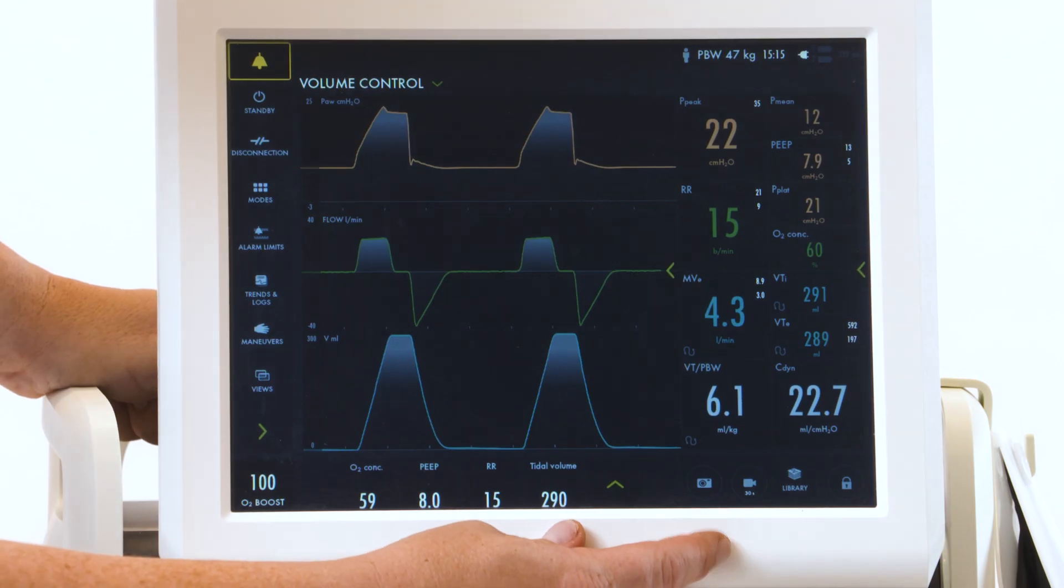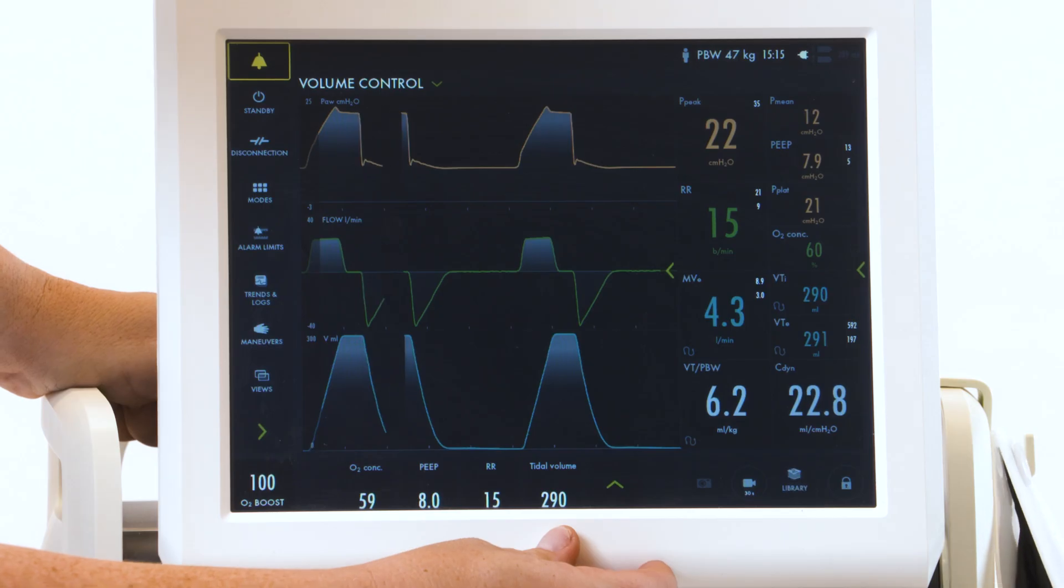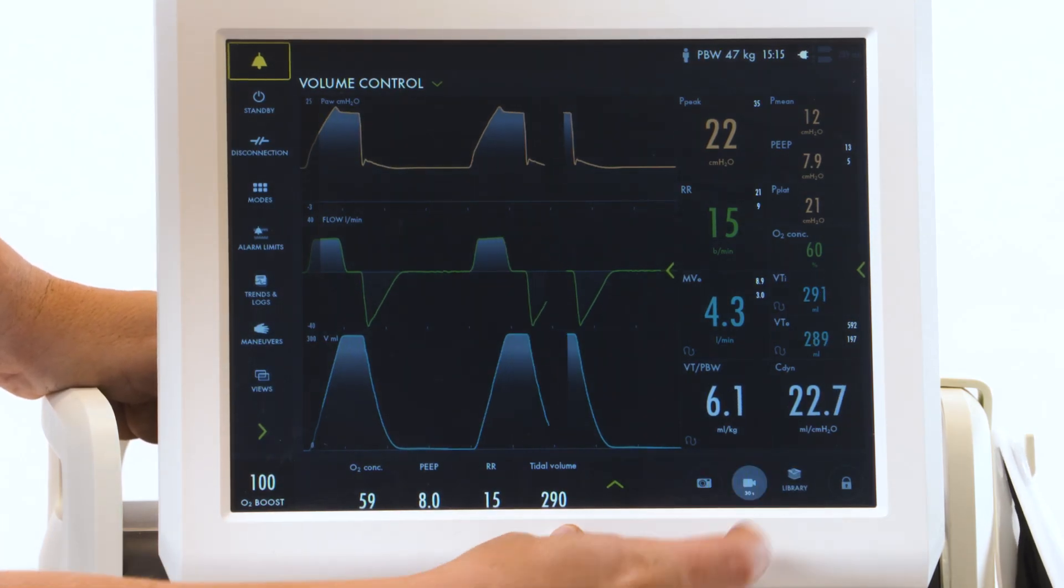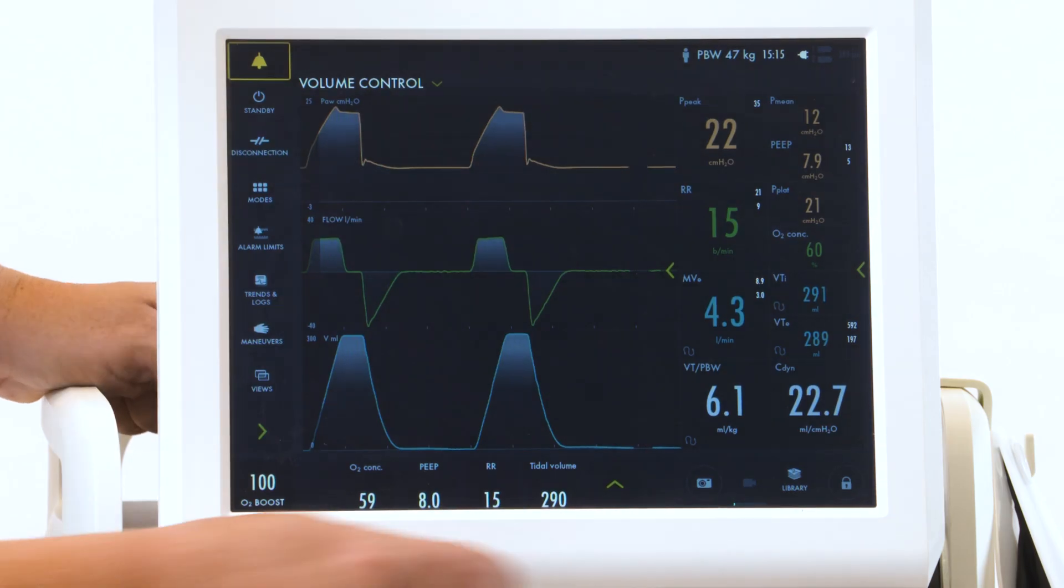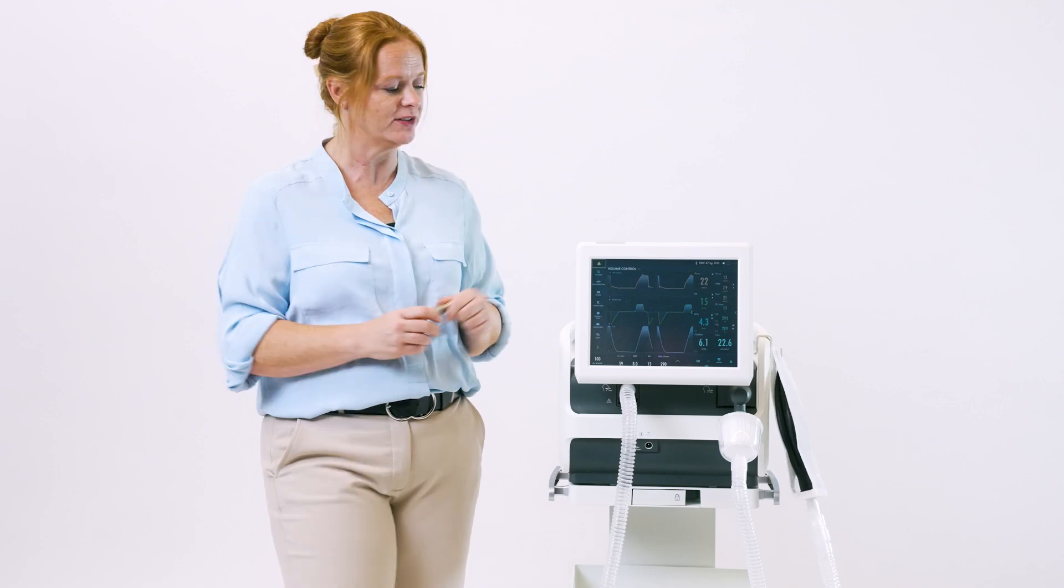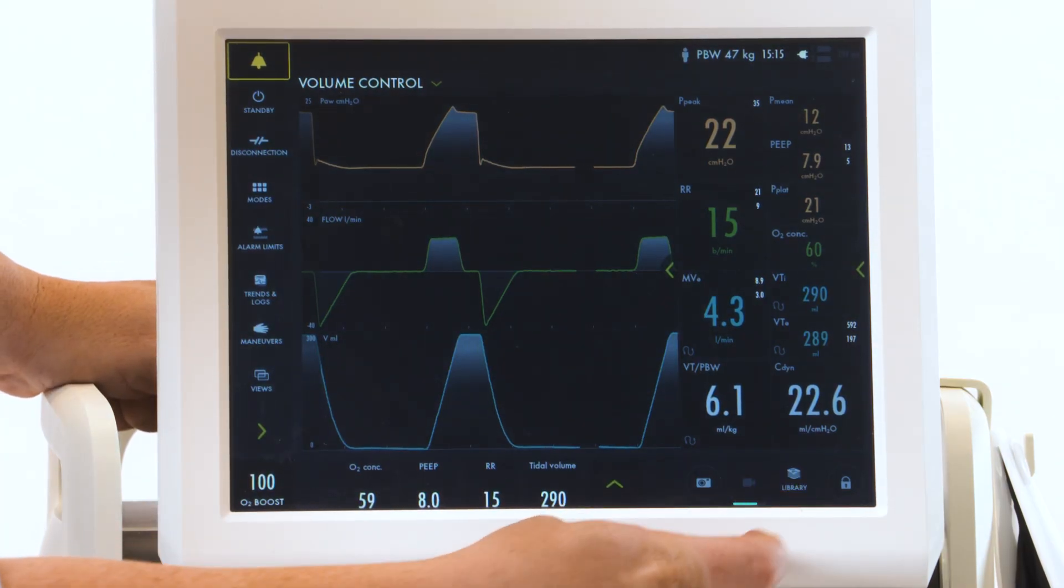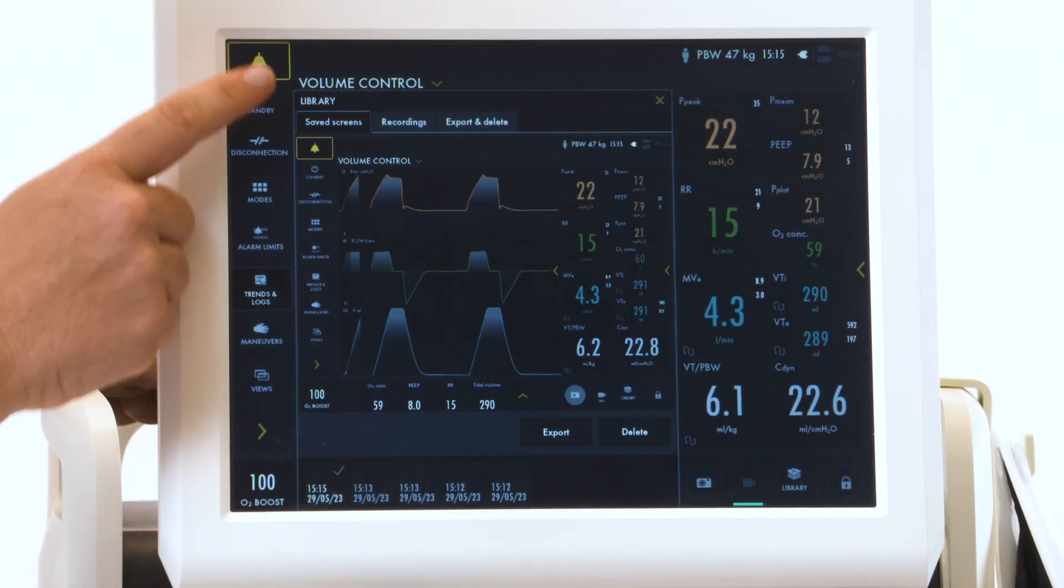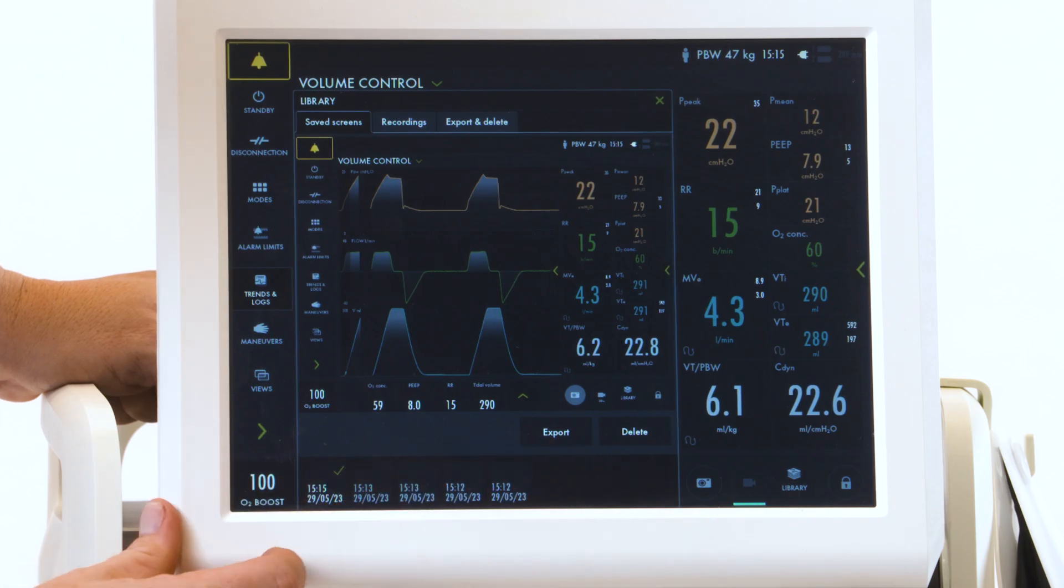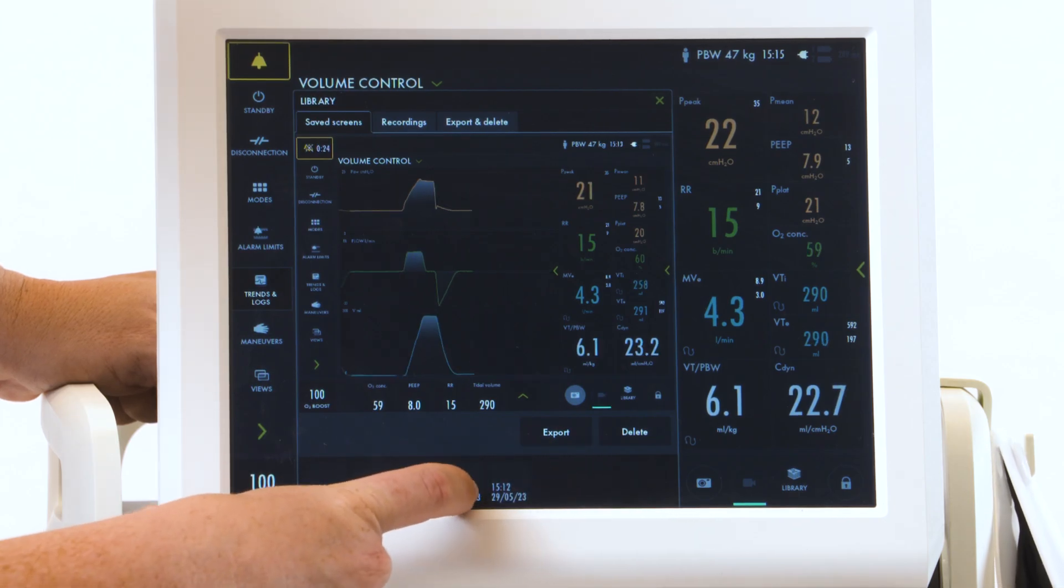It is possible to record and save screenshots and recordings of your scalers. Down here, touch the camera in order to have a screenshot. Next to it is a record feature. It will record for 30 seconds, 15 seconds before and after you touch.